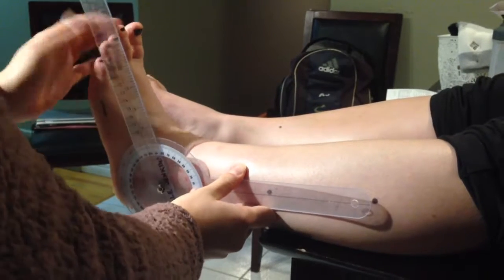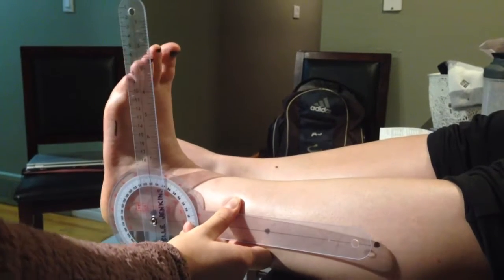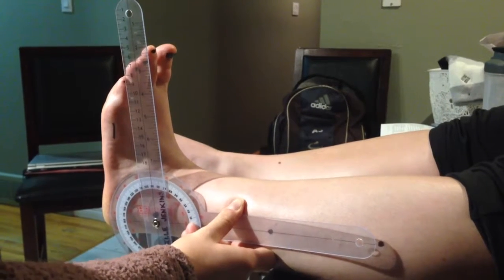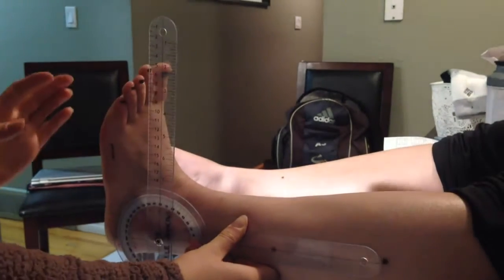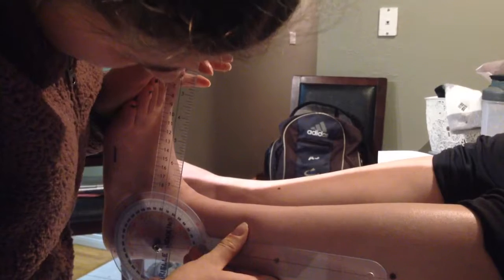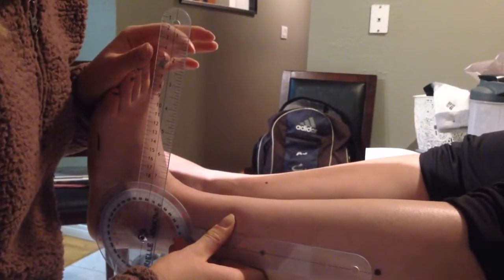So I'm going to start her in neutral at 90 degrees, or subtalar joint neutral. Can you bring your toes towards your nose? Okay, and normal for this is 20. I'd say that's about 11. I'm gonna measure it with the goniometer. And I'd say that's 10 degrees. Okay, and I'm gonna apply overpressure to this. Okay, I'd say that's about 15, and it is 14, and there's a soft tissue stretch and feel.